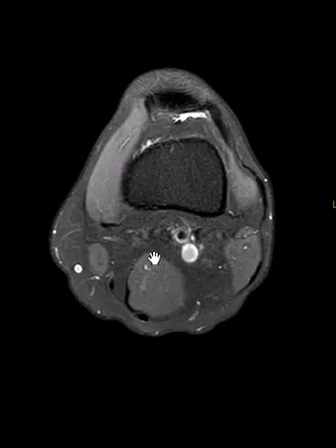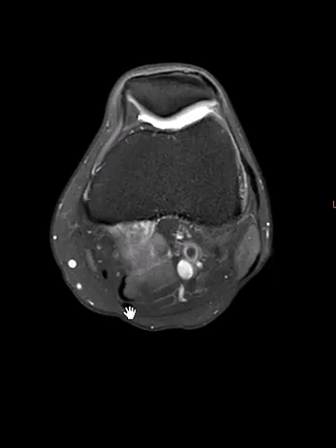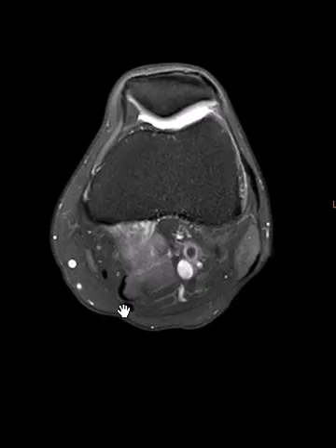So the semimembranosus is right here. This is the muscle — that little dark area is the central tendon, and behind it is the semitendinosus. So semimembranosus in front, semitendinosus behind.